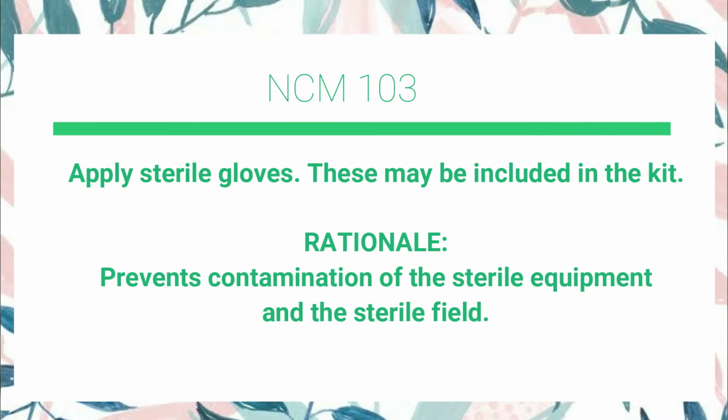Apply sterile gloves. This may be included in the kit. It prevents contamination of the sterile equipment in the sterile field.